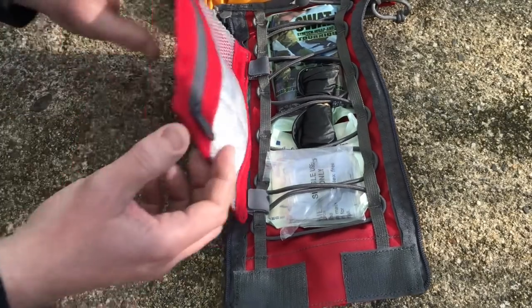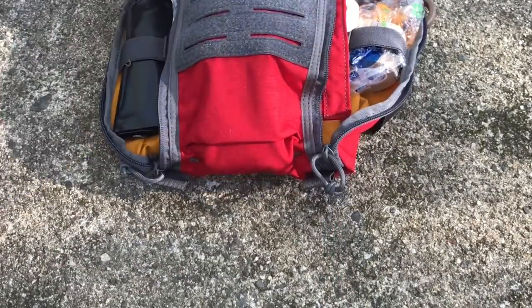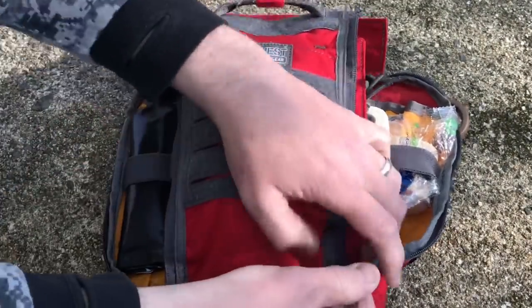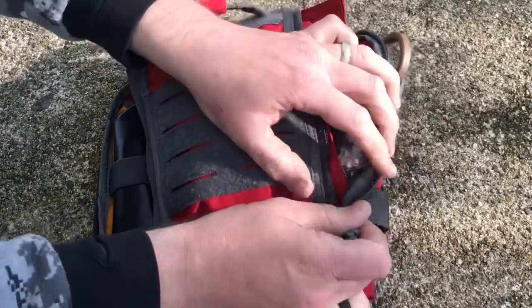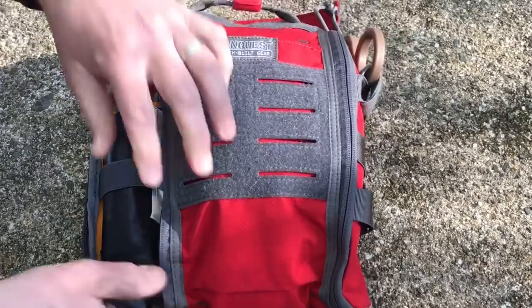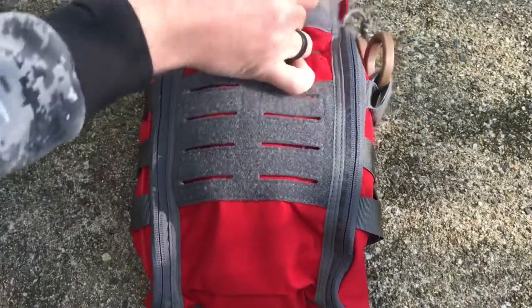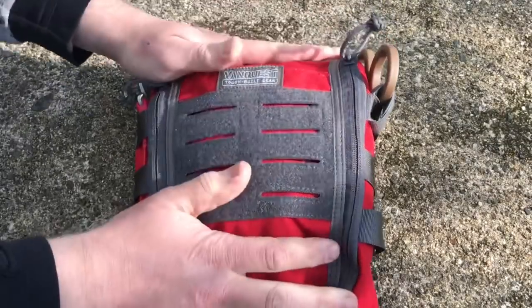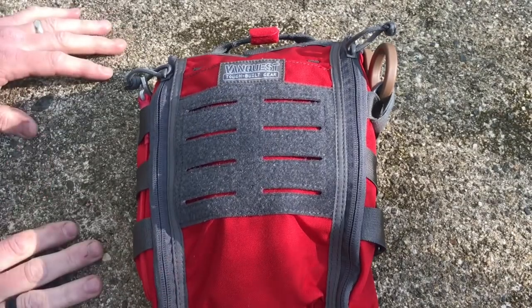Let me show you the closing process. This folds like this, then folds up, and then you run the two zippers up the sides. Once you get it all organized and cinched down, all you've got to do is grab that handle, yank, and the whole kit is displayed for you.